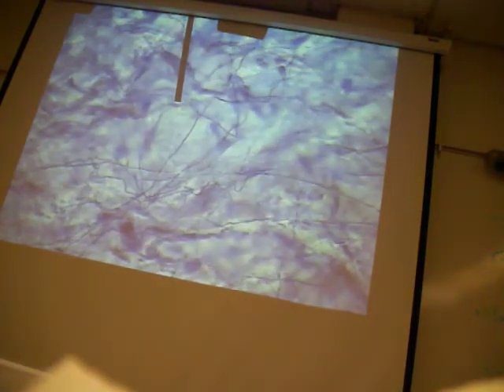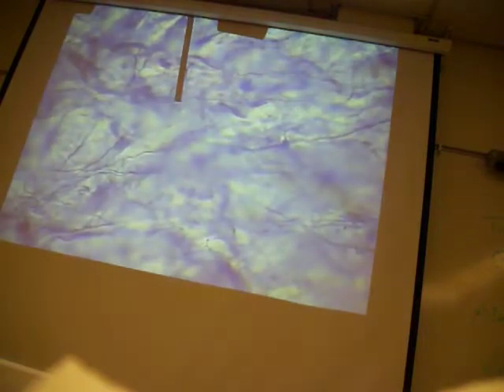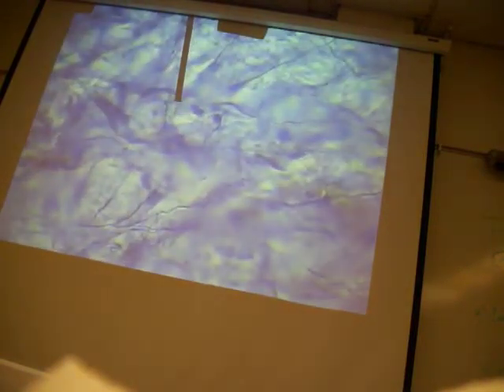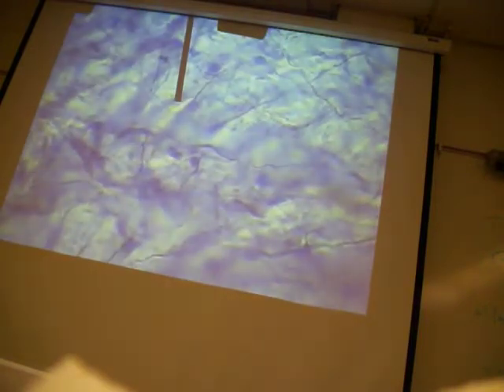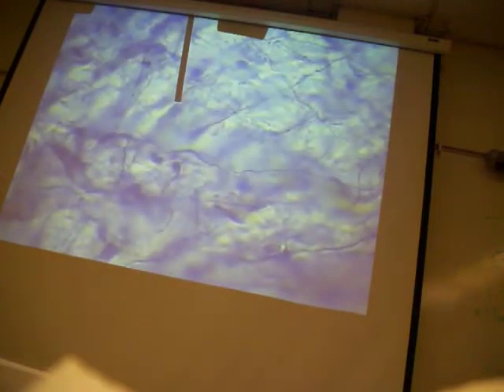Now in areolar connective tissue, see those what look like nuclei in there? These are the fibroblasts. Some of these larger cells that you're looking at are probably macrophages, because we're not staining specifically for them. So this large one.